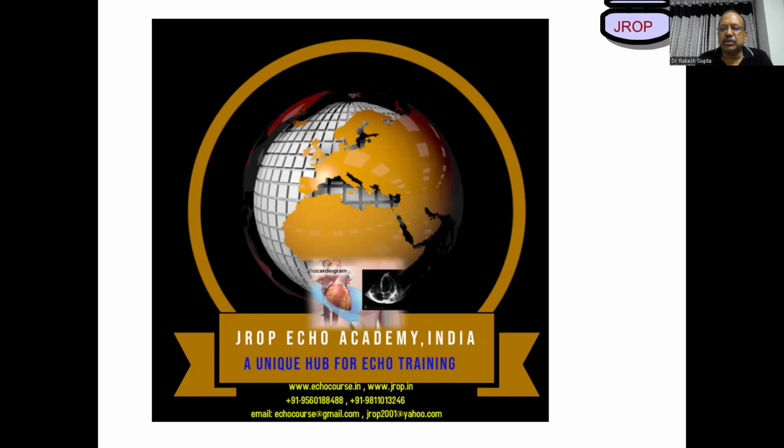Good evening, everybody. Welcome to this 49th comprehensive course on echocardiography. Today, we are going to have another session on prosthetic valve evaluations, how they look normally, how they look abnormally. In fact, if I'll say for the first words, they're almost like normal valves. However, these prosthetic valves are slightly smaller in size as compared to native valves. That's all I would like to say and start with this procedure.